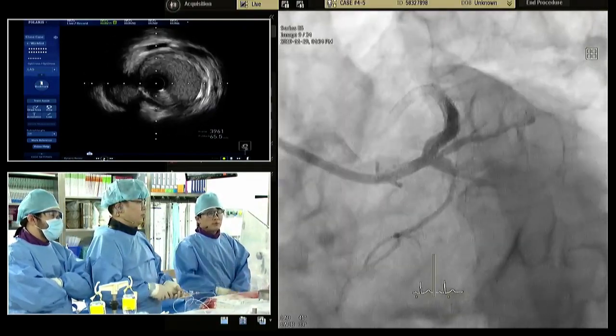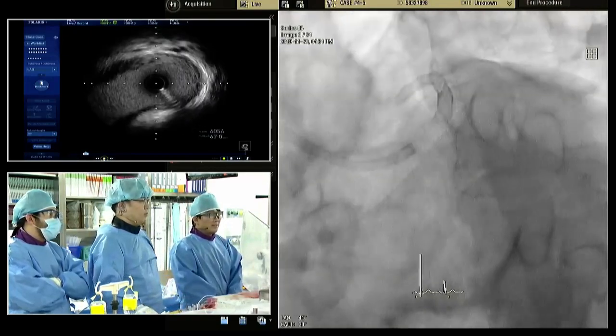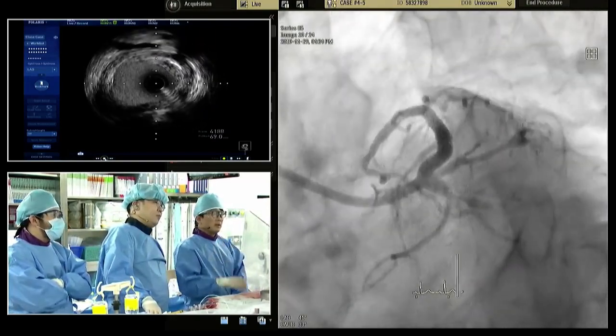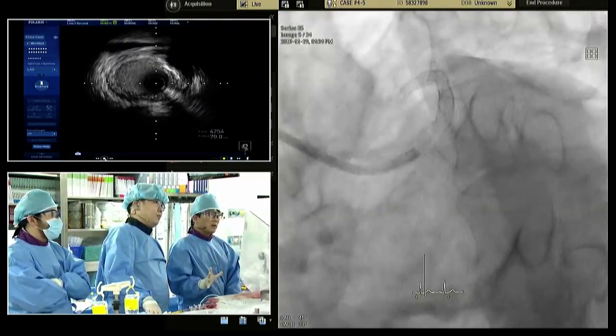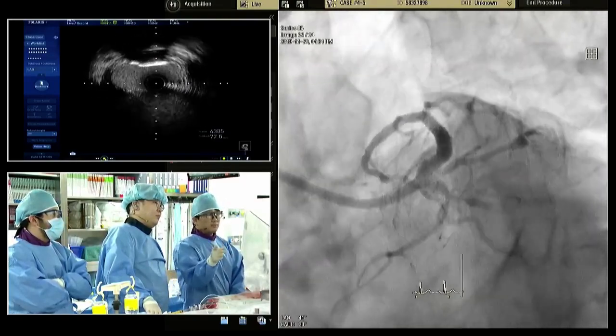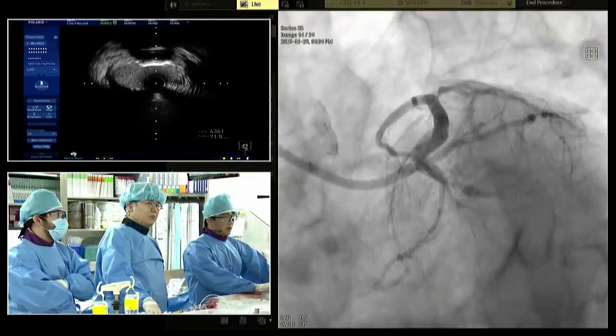What type of stent is this? Is the main visible? The main is okay. There's a little bit of disease at the distal main, but the lumen is okay. The 6 French guide is very short, like this. The guide is impacting into the main, right? Compared to the proximal part.